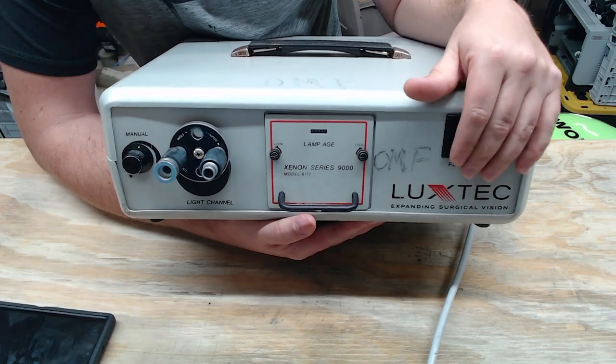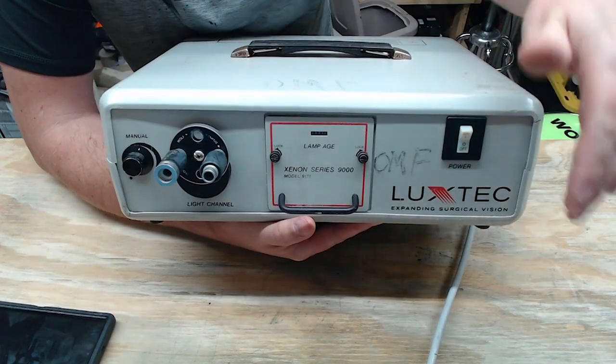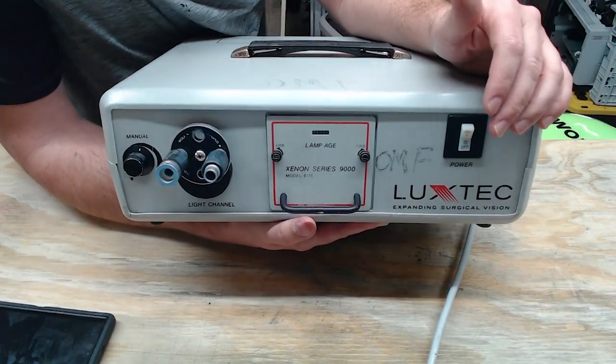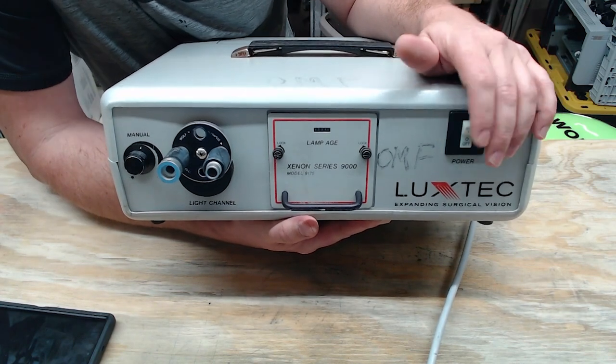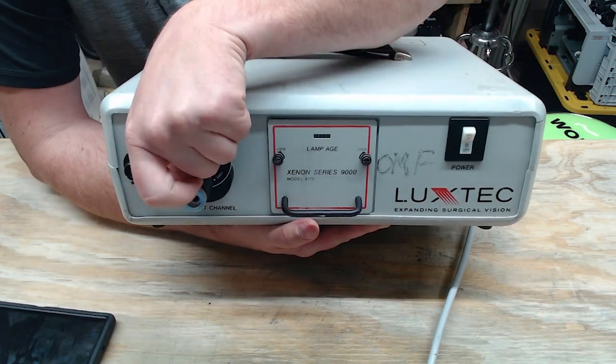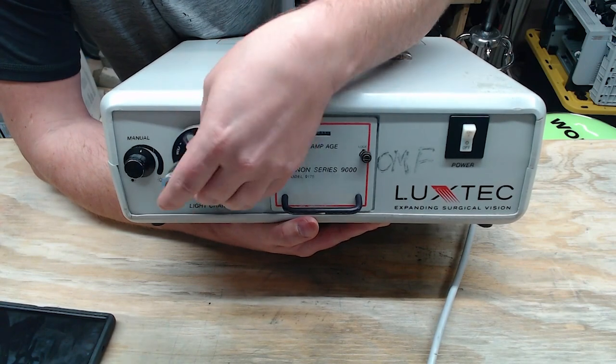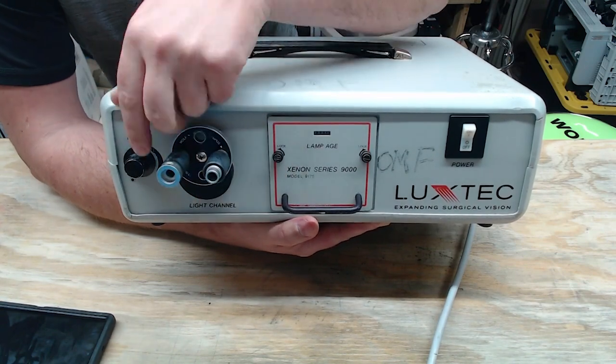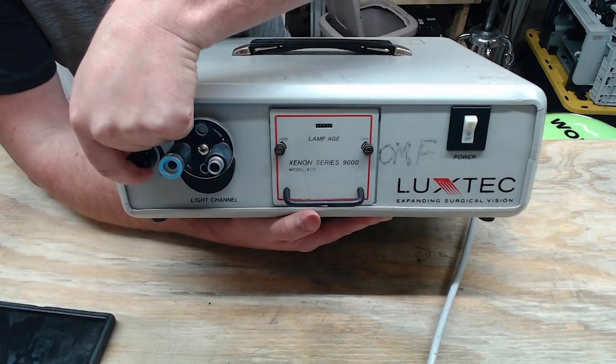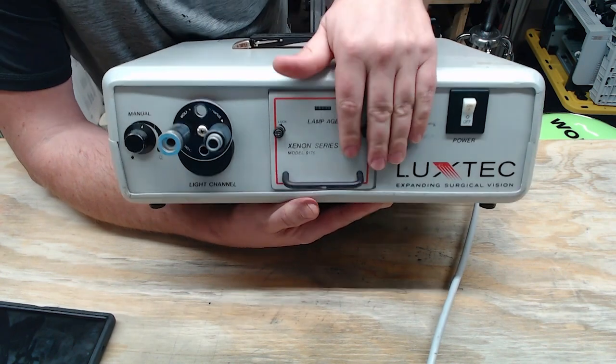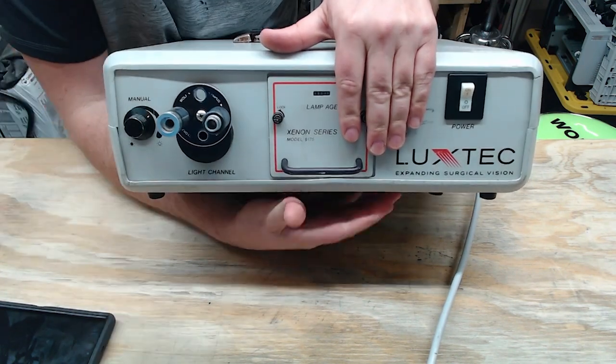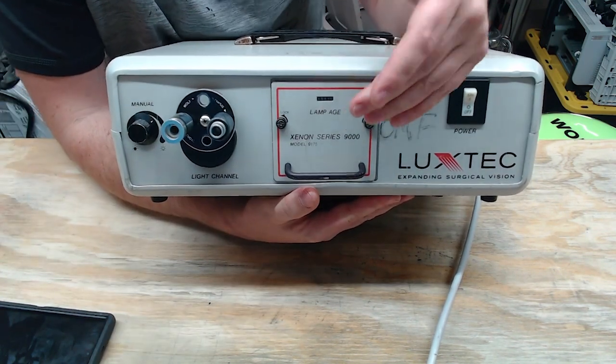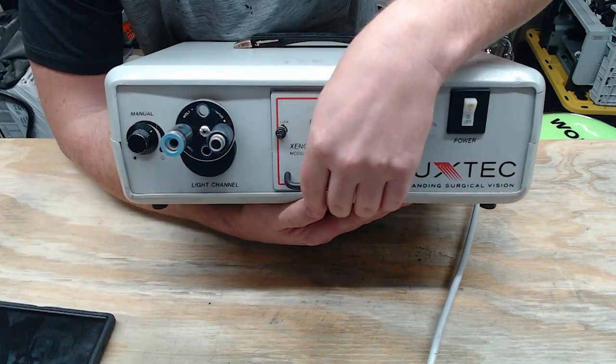But on the front panel, this is pretty much generic of all light sources in one way or the other. Here, you have your power switch, of course. You have your turret, which some of them don't have turret if they're proprietary. You have a diffuser right here, which dims the light. And on this particular model, you have the light module itself, right here.